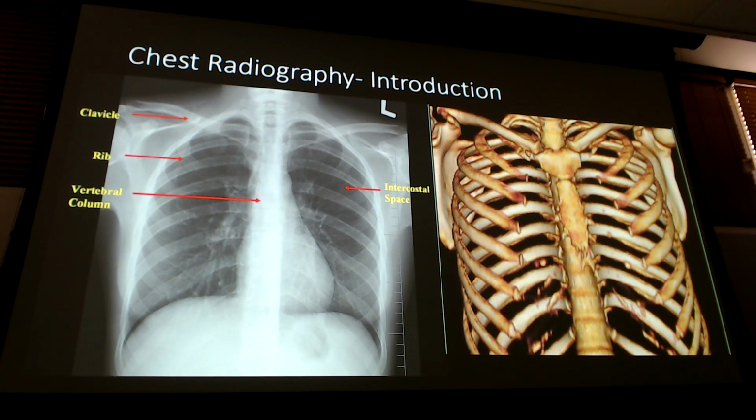So now what this is, this is a CT over here that was reconstructed. Remember how we saw some of those in the first block, where it took that knee CT and reconstructed it so it looked like a 3D model of the knee? That's what this is, to show you where that cartilage starts, right? This is all just looking at bone. So no, they didn't break their rib cage open here. That's the cartilage. That's why we can't see that on the x-ray, because it's not there.